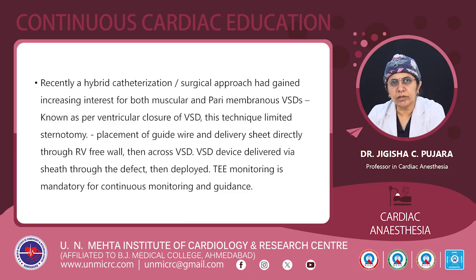TEE will guide the position of this guide wire across the VSD, and the VSD device is delivered via the sheath through the defect, then deployed. TEE monitoring is mandatory for continuous monitoring and guidance. So exact placement of the device is guided by the TEE only.